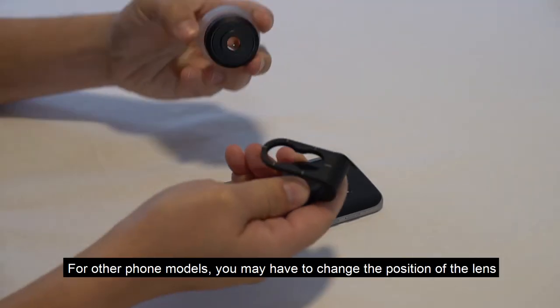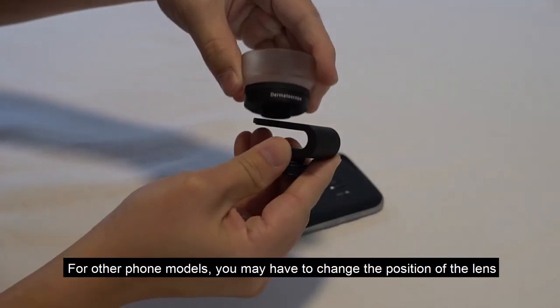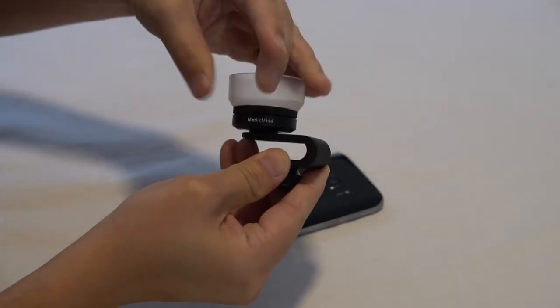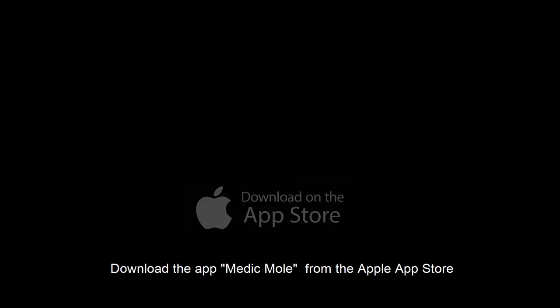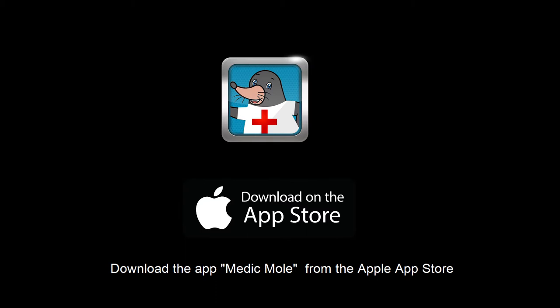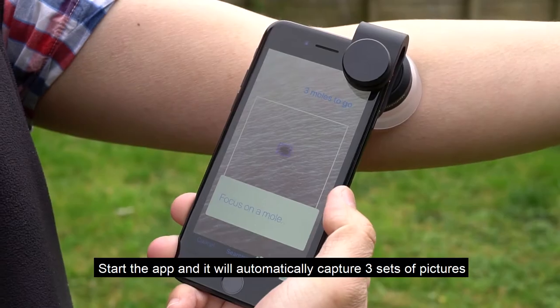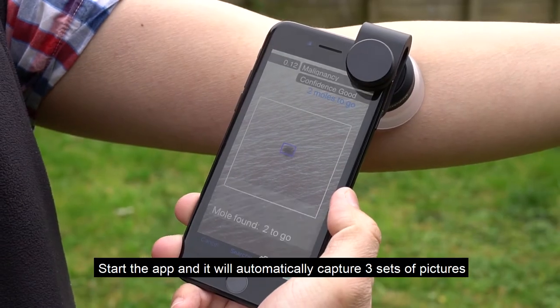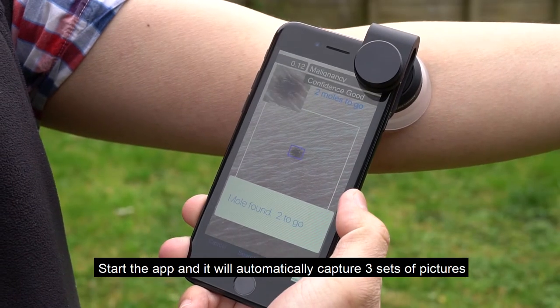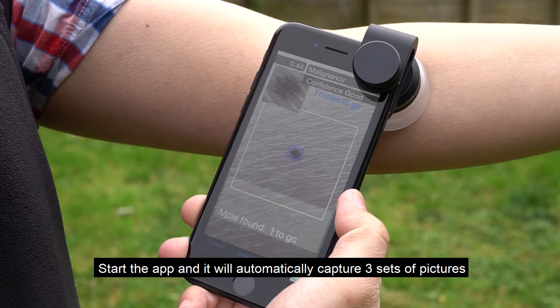For other phone models, you may have to change the position of the lens. Download the app Medicmole from the Apple App Store. Start the app and it will automatically capture three sets of pictures.